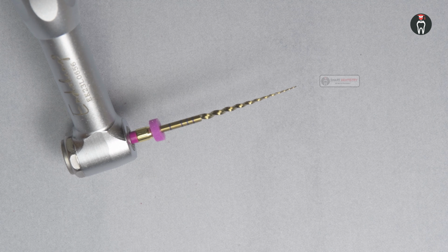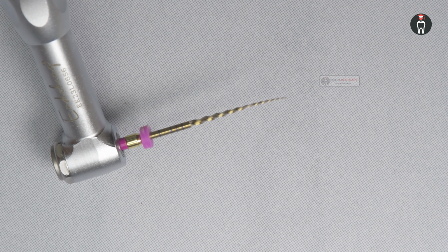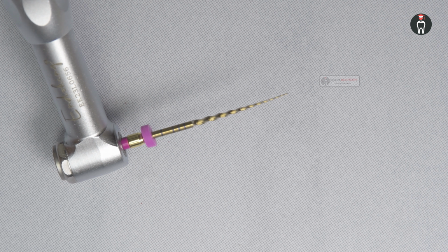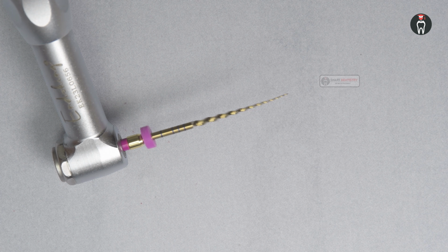I have made this video at a very slow speed so that you can see the file rotating clockwise, counterclockwise, clockwise, counterclockwise in a repeated motion. This is called a reciprocative motion. The advantage of the reciprocating motion is that it will not screw inside, because the file is not rotating in the same direction. It just rotates clockwise and counterclockwise, maybe at 30 to 60 degrees, depending upon the type of file we are choosing. So the file will never get screwed inside the root canal.